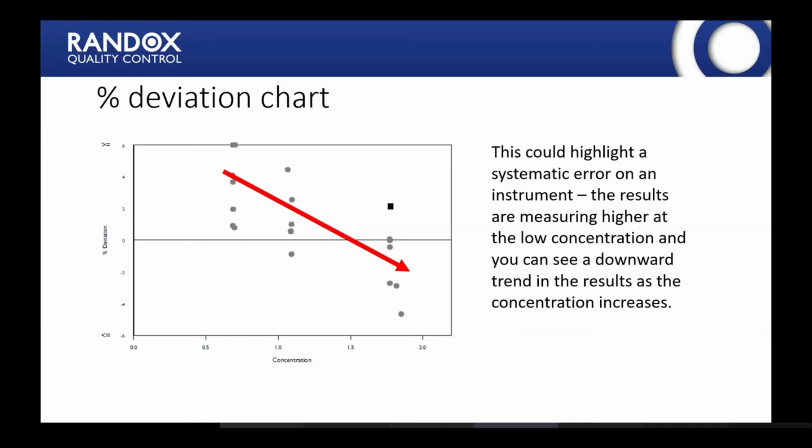So we can use the percentage deviation chart to establish if we have a bias at a particular concentration level, and we can also, as you can see in this instance, identify a possible systematic error with the instrument. So at the lower concentration level, the results are higher than the mean for comparison, and as the concentration increases, we can see there's a downward shift in the level of the difference between the mean for comparison and the lab's result. So here we can see at the lower concentrations we're measuring higher, and at the higher concentrations we have a more normal spread of results on either side of the mean for comparison. So again, the lab will need to look at this lower concentration and see if there's any action they want to take to address the fact that they have this positive bias at the lower concentration level.